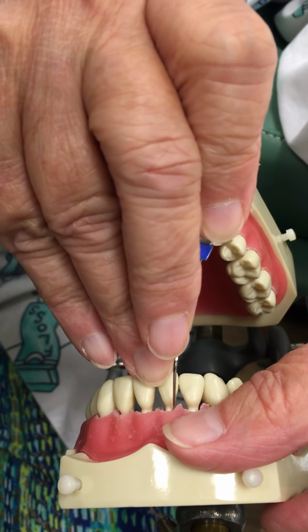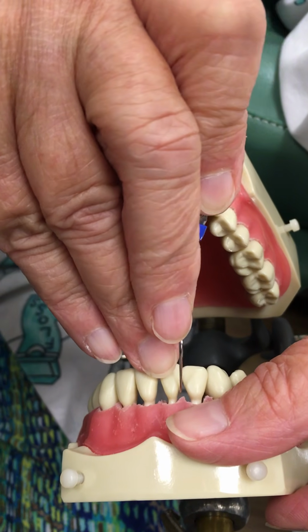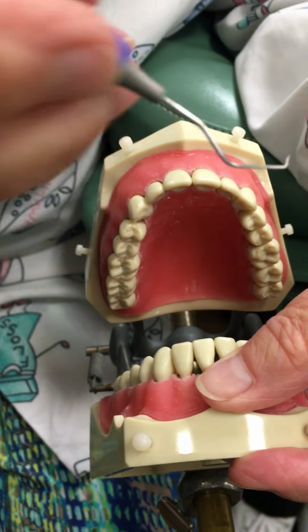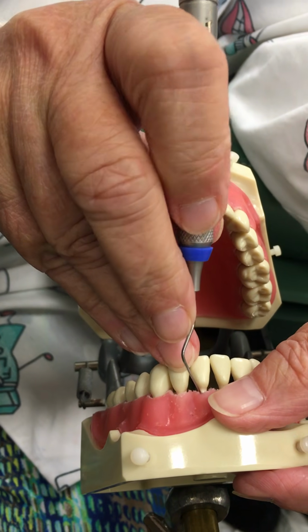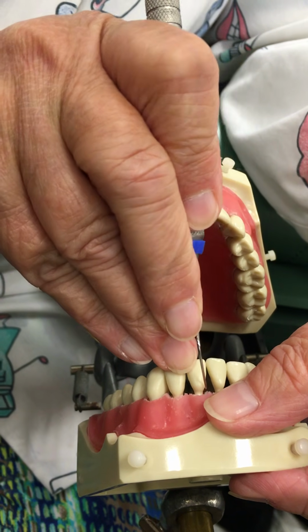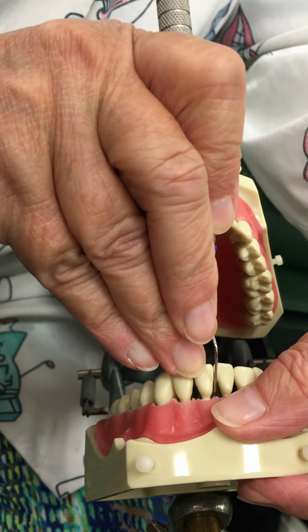Toe on, heel off, so every stroke is rolled. And then you'll need to turn your mannequin because you're going to start getting really tight in here. And adjust your grasp as you move from tooth to tooth.